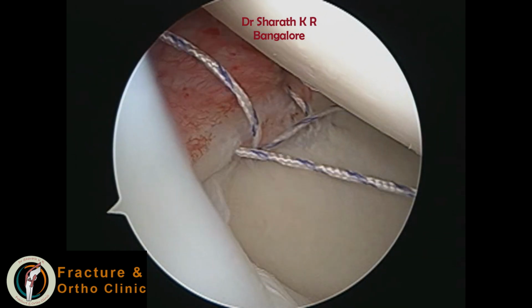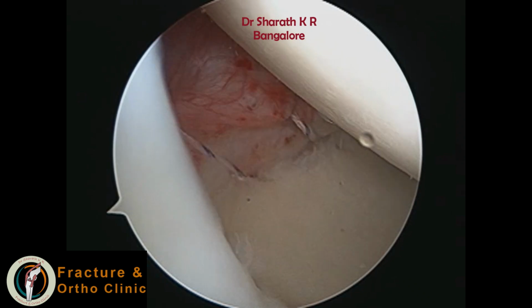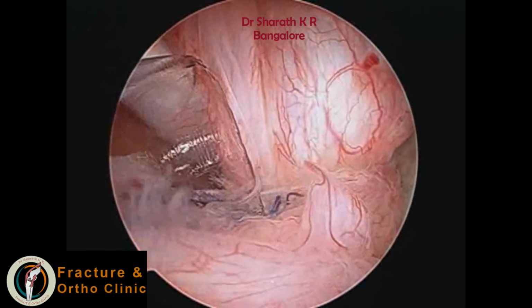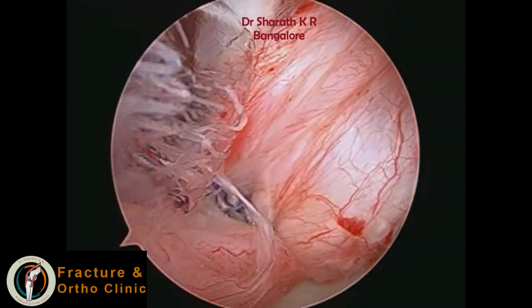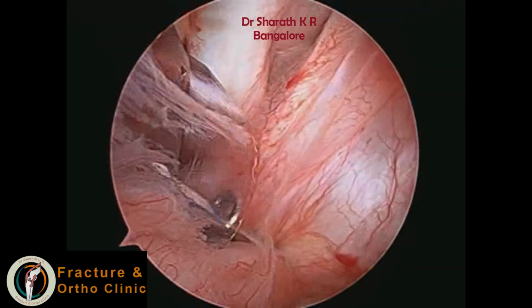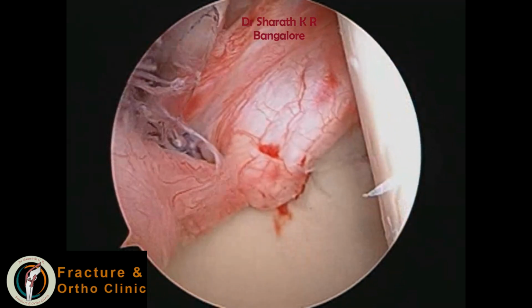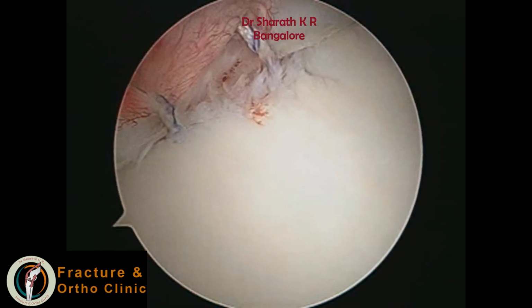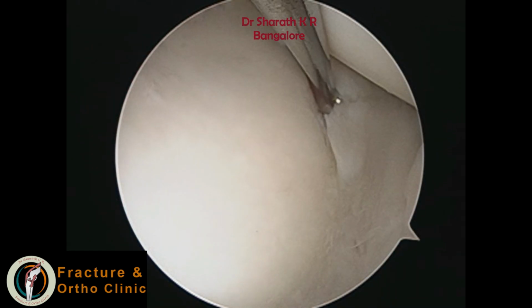So it is very important for us to make a big soft tissue chunk to be held when we put the first and second anchor, so that the third anchor is for completion's sake, but the resistance to dislocation is mainly by the anterior inferior and inferior soft tissue structures. You can see that now there is a nice bump formed anteriorly. It is completed by three anchors and fixation is done.